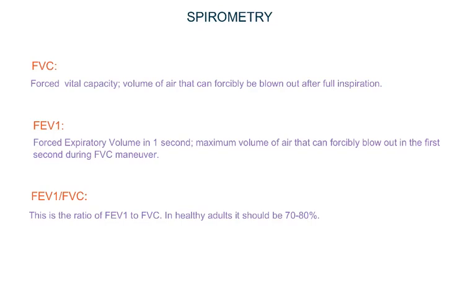FEV1, which is forced expiratory volume in 1 second, is the maximum amount of air that is expired in the first second during the FVC maneuver. The ratio of FEV1 to FVC in healthy adults should be more than 70%.